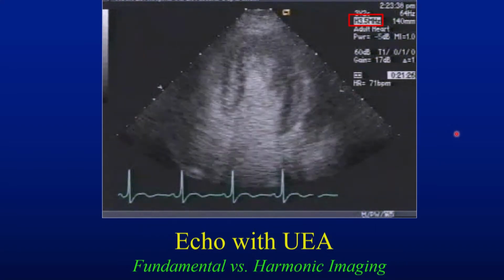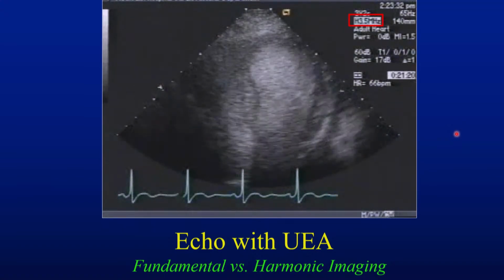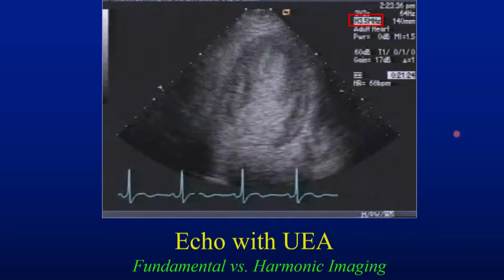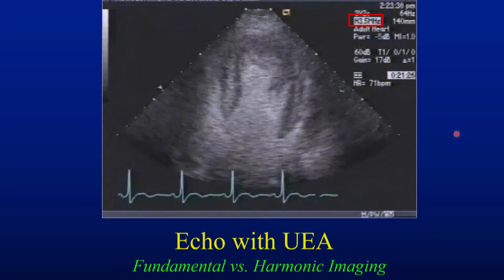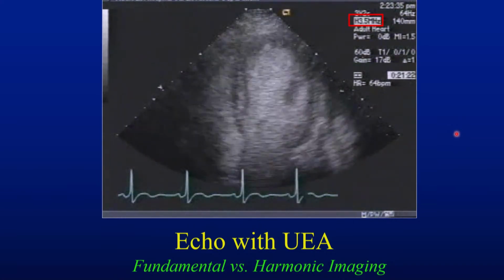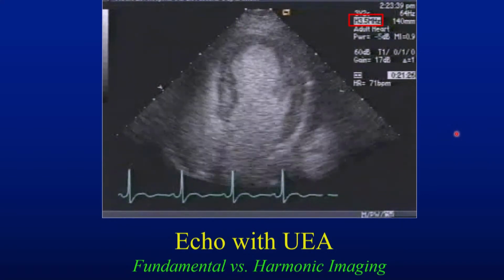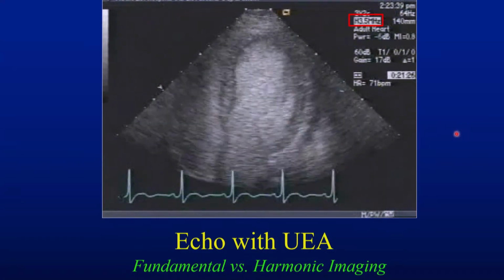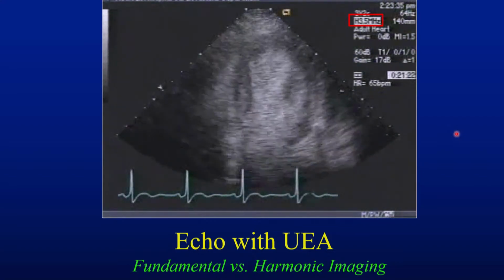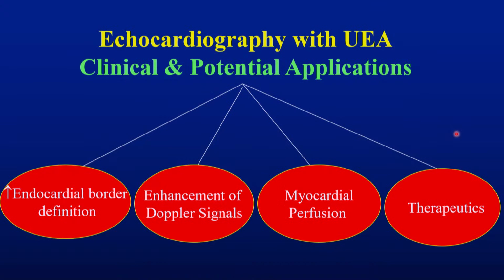So for us to image well, we have to understand mechanical index. And the good thing is nowadays you have presets. So if I'm using contrast, I'll go to the contrast preset, which presets it down to a lower mechanical index. You still have to know how to inject it, right? And use harmonic. And most of the time nowadays you use harmonic even for regular imaging, so it's lesser of an issue, right? So I think these are the major principles.